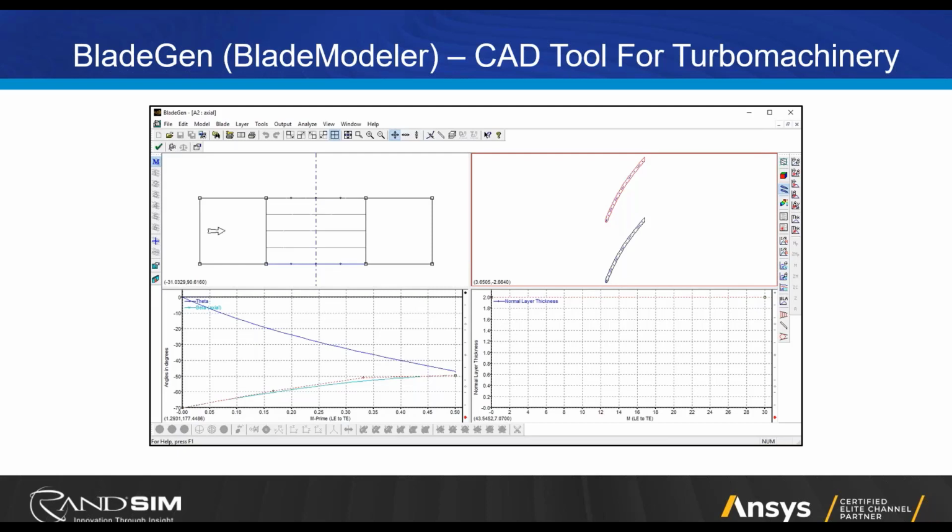You know, you look at it in 3D, it looks very complicated, but this allows you to look at it in 2 dimensions. This view on the top left is called the meridional view. And that's what you would see if you kind of took the mean line between these 2 blades here on the right side and pulled it and stretched it out, flattened it out. That's what it would look like. This is an axial device, so the hub in this case is constant diameter, and this is the shroud. It's also constant, so it just looks like a simple rectangle in the meridional view.